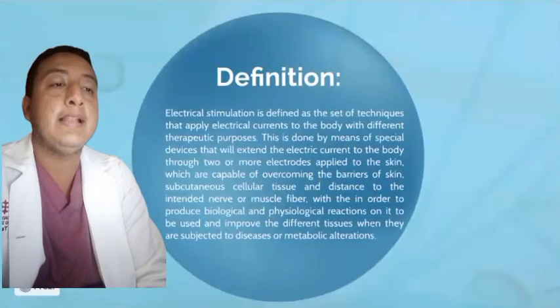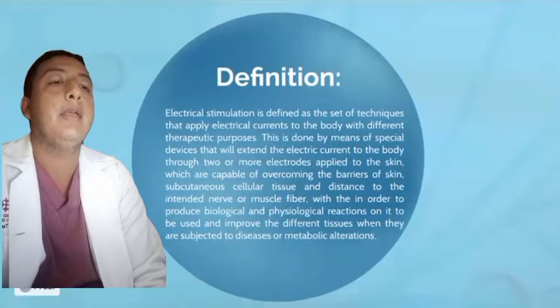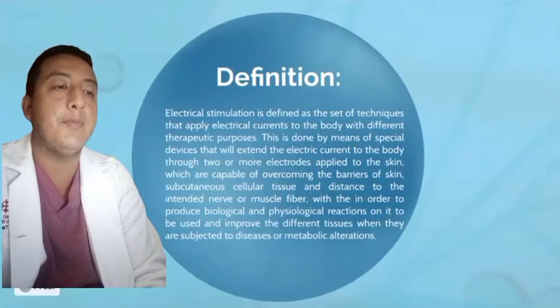Definition: electrical stimulation is defined as the set of techniques that apply electrical current to the body with different therapeutic purposes.